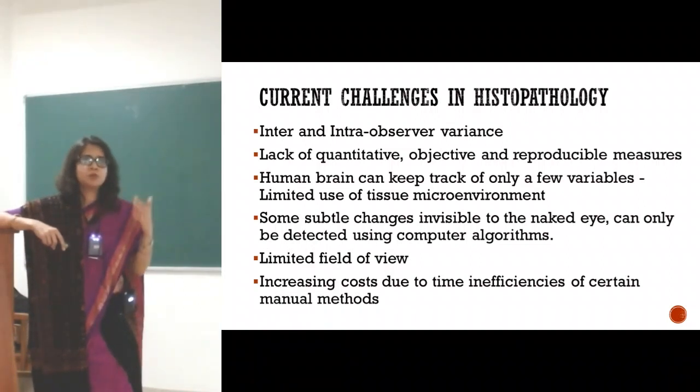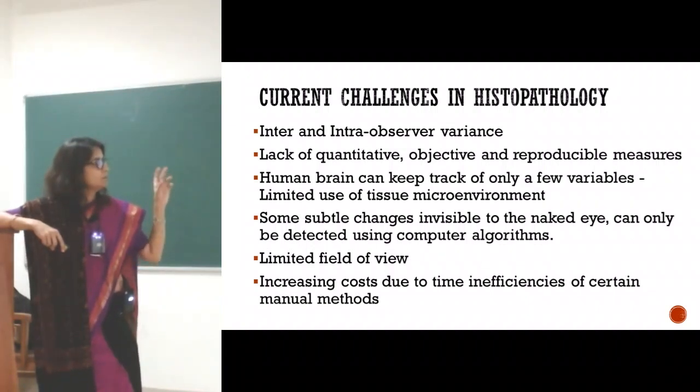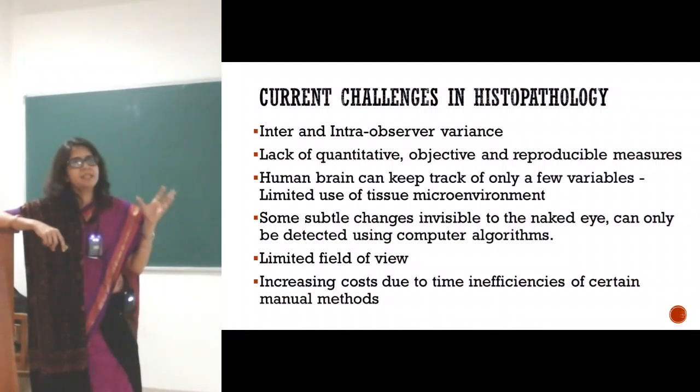So these are different prognostic features which we look for in a tumor when the pathologist is reporting. And these prognostic features make a big difference in the treatment outcome, in the prognosis of the patient, and in the way the doctor decides what treatment to give the patient. All these features make a difference. But with humans, it's very difficult to accurately report all these different criteria. And we feel the machine can probably do this better than we can.